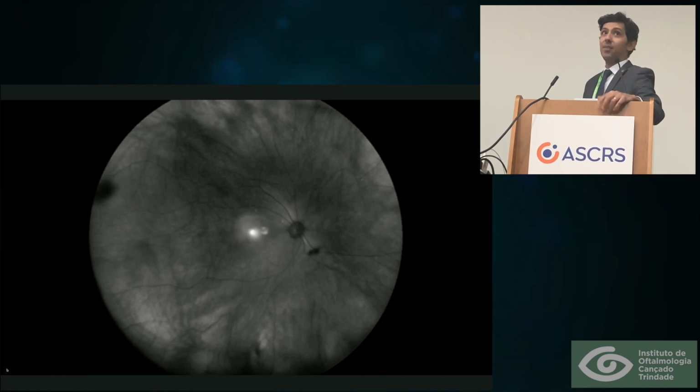When we get a very good dilation after surgery, we can still perform indirect ophthalmoscopy beyond the occlusive portion. So we are talking here about a pupil size of more than 8-9 millimeters to get a good peripheral examination. But it is important to note that this is possible. And it might be useful in those cases where the patient reports some floaters or some flashes, so it's important that you are able to examine the periphery.